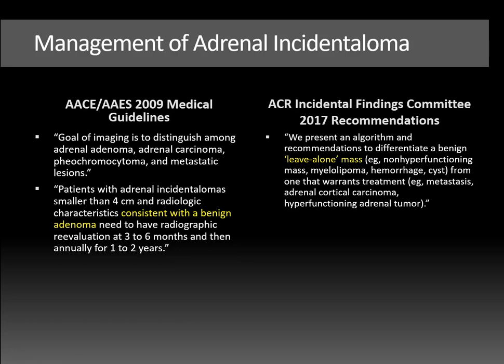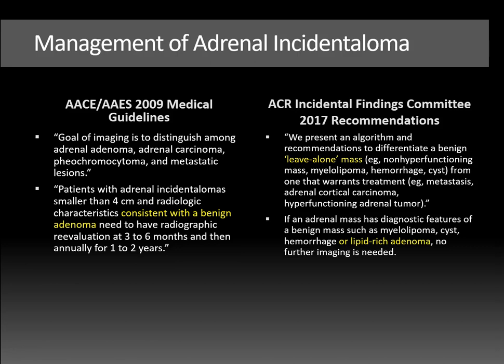Young's recommendations. However, the radiology recommendations state that if an adrenal mass has diagnostic features of a benign mass, such as a myelolipoma, cyst, hemorrhage, or lipid-rich adenoma, no further imaging is needed. So you see a major difference there between the two algorithms, whereas radiology states that if it's a non-functioning adenoma, we don't need to follow it up anymore.